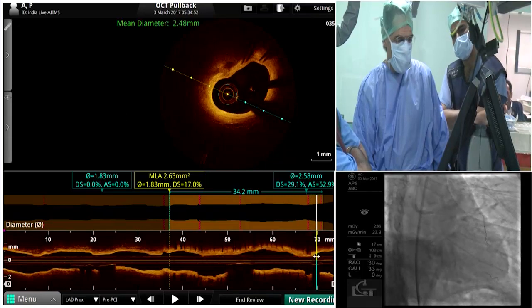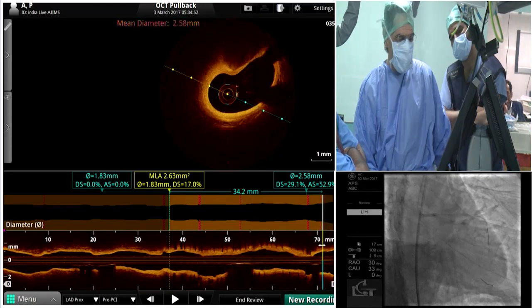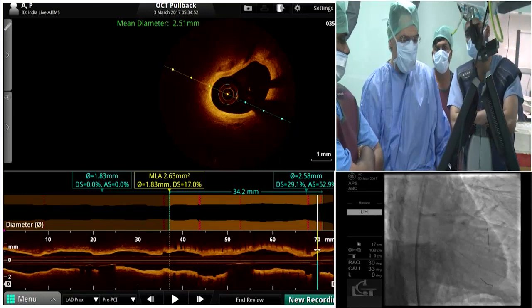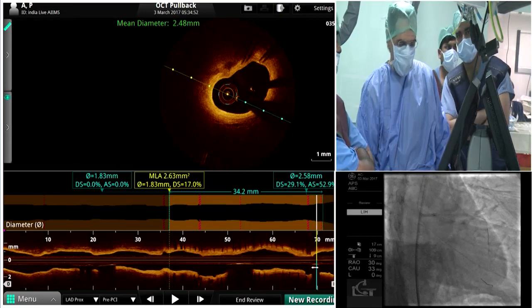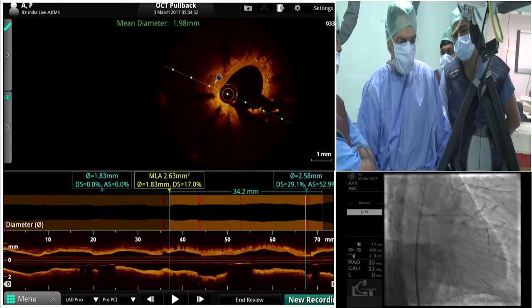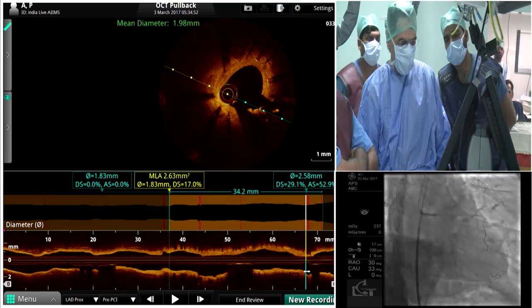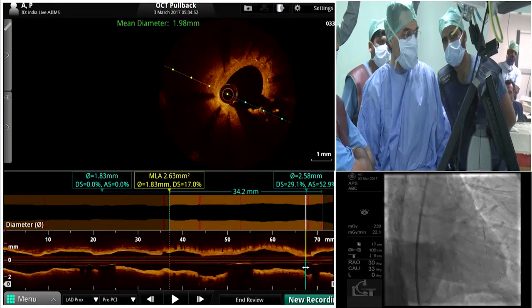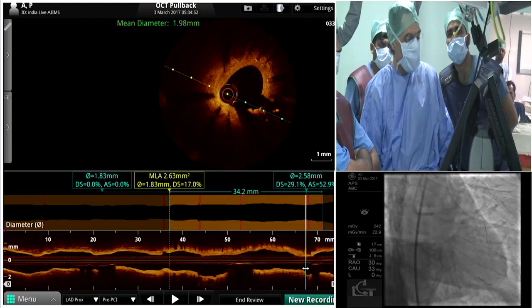This stent is going inside, where there is some stenosis on the distal left main before getting into the stent. And the area is about 5 millimeters square. Then the stent is starting in the left main, and then you have the shadowing of the two wires. This is the approach of the circumflex. And in fact, you can see that the cell that was crossed was exactly the distal one. Because immediately afterwards, you can see that you don't have any more access to the branch.